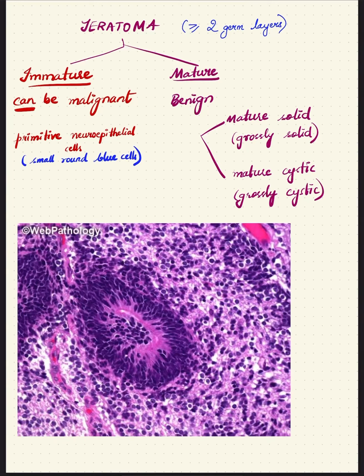Today I want to discuss a case that I have received in my department, which was reported to be a mature cystic teratoma.